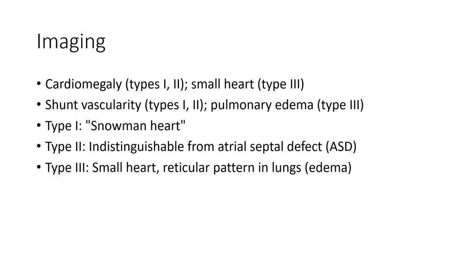Imaging findings on chest radiograph: Type 1 and Type 2 show cardiomegaly, while Type 3 shows a small heart. Vascular markings differ: Type 1 and Type 2 show increased pulmonary vascularity and pulmonary edema, while Type 3 also shows pulmonary edema. Specific radiographic signs: Type 1 shows the classic snowman heart appearance; Type 2 shows indistinct cardiac borders; Type 3 shows a small heart with reticular pattern indicating pulmonary edema.